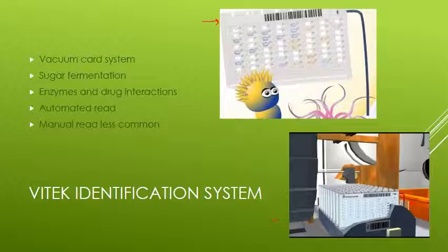One's a little bit smaller than the other. One of the benefits, I would say, of the Vitek system is that no reagents are added. The reagents are all built into those little tiny bubbles, those little pockets for the solution.